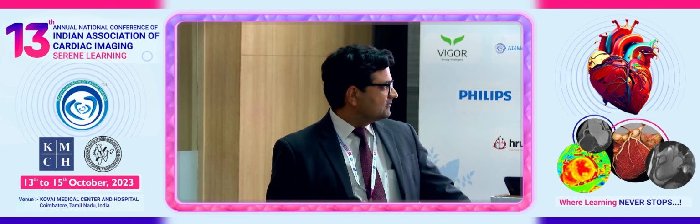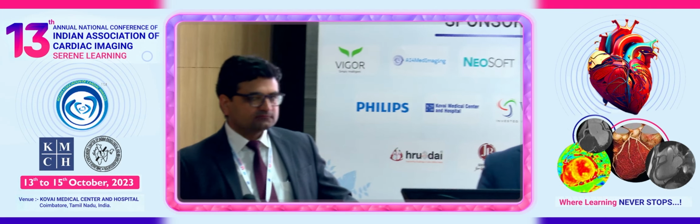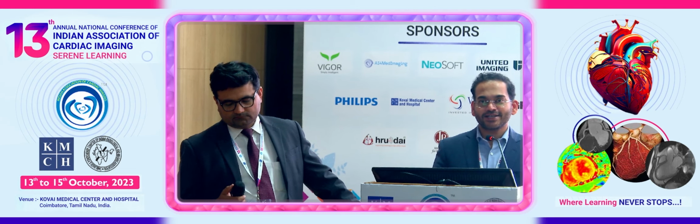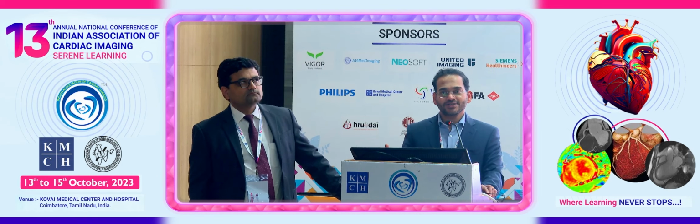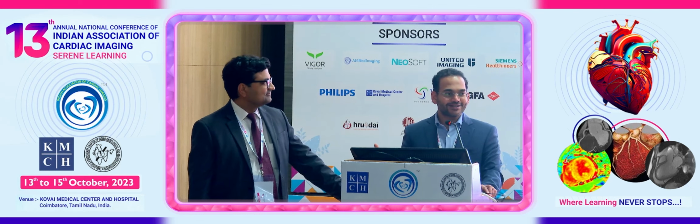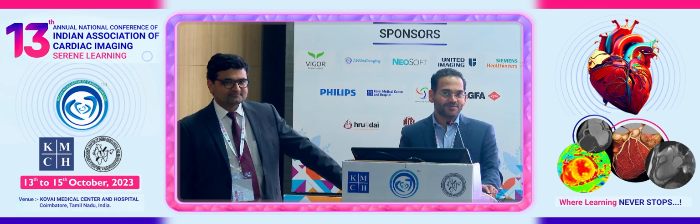It is a known problem with coronary calcium score, particularly if you have motion, as you said. The right coronary artery is the artery that moves a lot throughout the cardiac cycle, so you can overestimate the degree of calcium score. There are centers in the world who do retrospectively gated calcium scores, believe it or not, but I think that's a little excessive, and the radiation dose tends to be very high just for a calcium score.